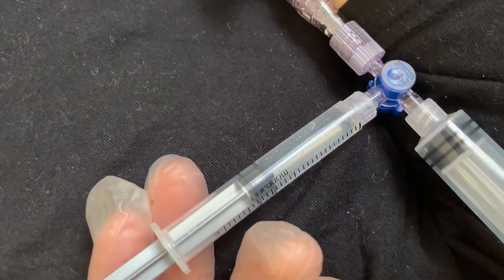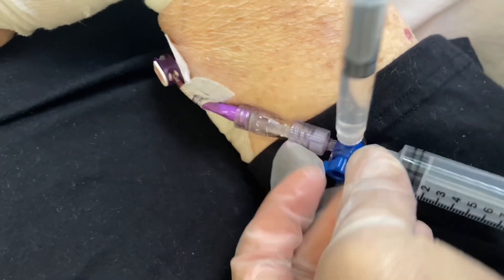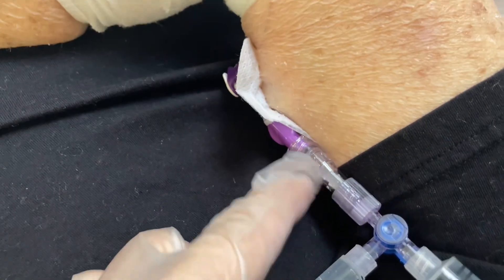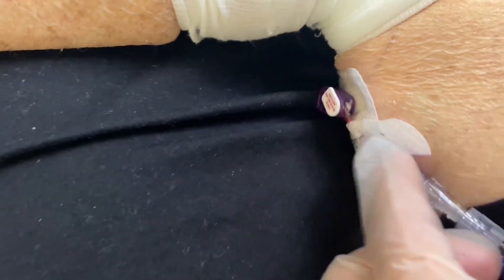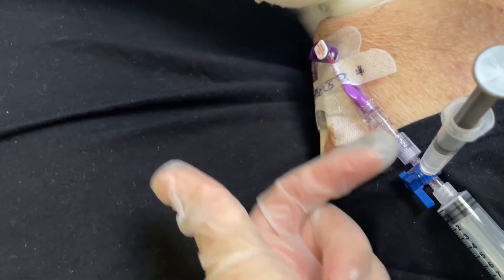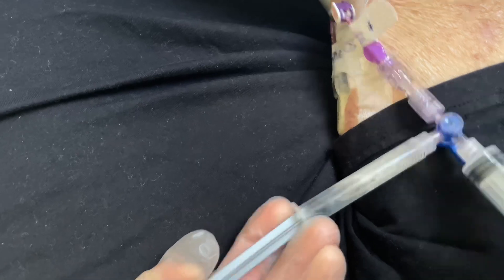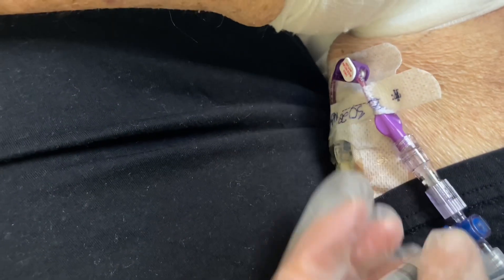As you can see, I have no air bubbles now. I'm going to close off this side, then suck in whatever space was left in here and exchange it with the cath flow so it starts touching that site. For a quick cheat, I'll just let it pop and use that agitation to exchange gas for liquid — that way it'll push and force the liquid further in.